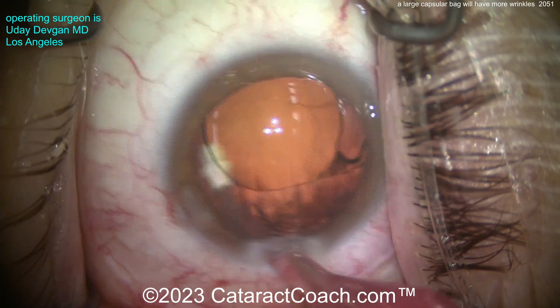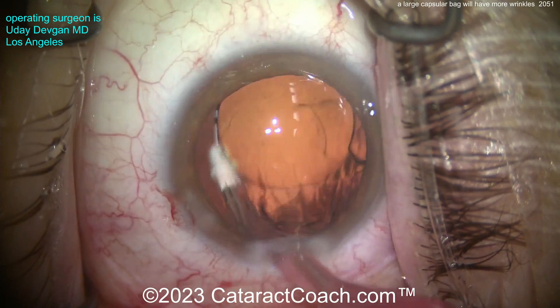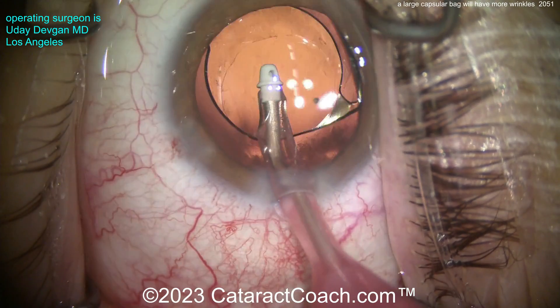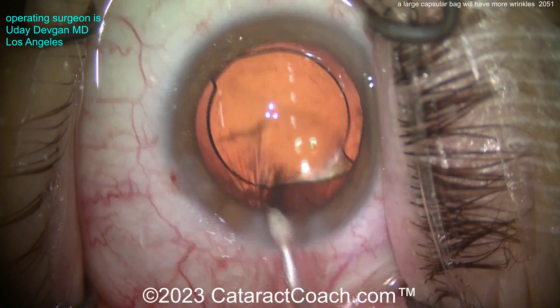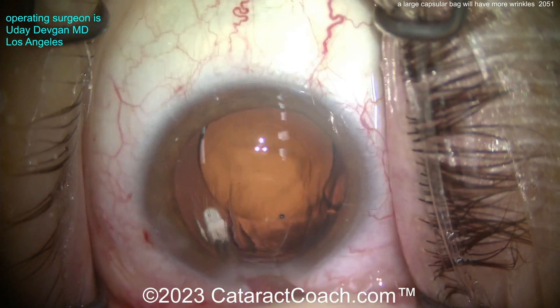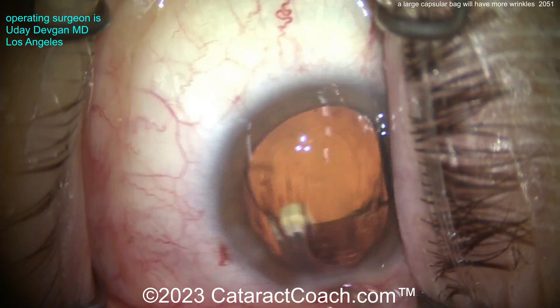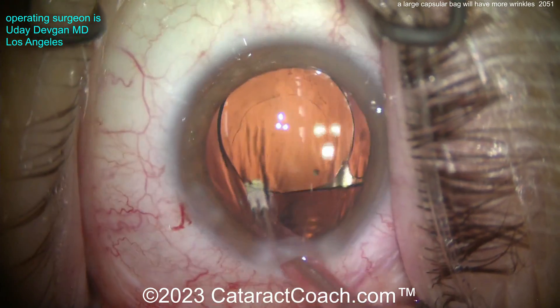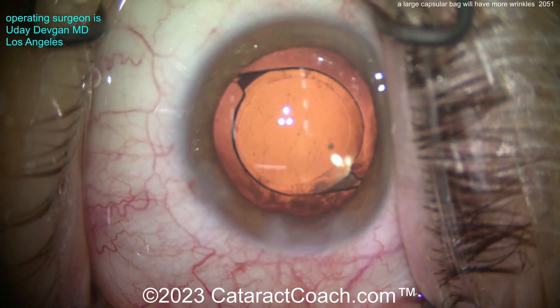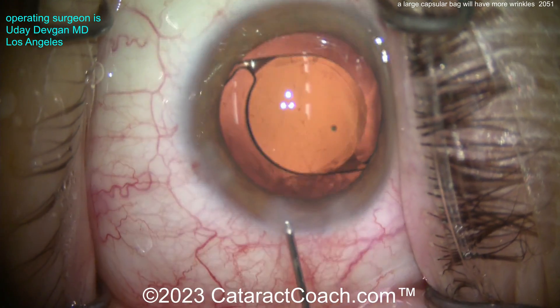Now taking out the viscoelastic from behind the optic and in the capsular bag — get all that out. We're also cleaning up the posterior capsule. You want to be really delicate here; the posterior capsule is four microns thick — about half the thickness of a red blood cell. Sealing up the incision. There's a little more material or smudge right there on the posterior capsule — we'll get that off. Now it looks pretty darn good. You see some vitreous opacities, some floaters — the patient will notice those, but they are pre-existing; we didn't put those there.